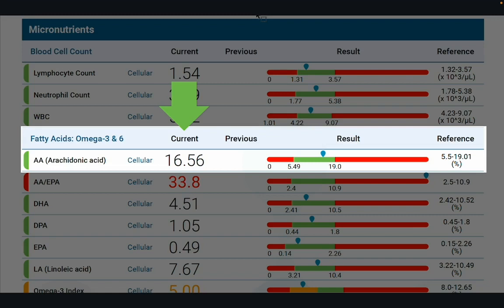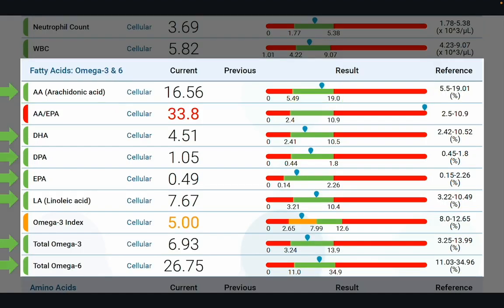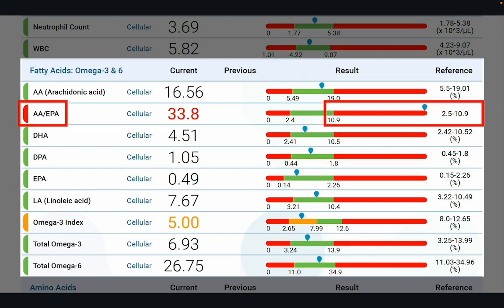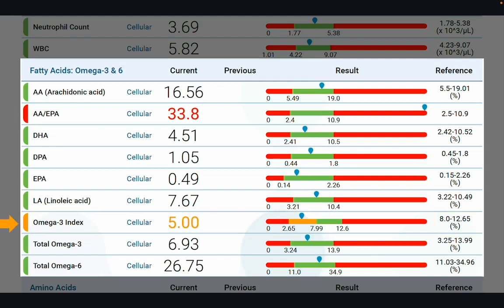Moving on to the actual nutrient levels: results are reported as both a number and plotted graphically, so you can visually see how high or low your patient's micronutrient levels are. Results in green indicate levels within the reference range — for example, this patient's levels of arachidonic acid, DHA, DPA, EPA, LA, total omega-3, and total omega-6 are all within range. Results in red correspond to levels outside the reference range — for example, this patient has an elevated AA to EPA ratio. Orange or yellow indicates suboptimal levels — for example, this patient has a suboptimal omega-3 index. Note that all fatty acids are based on intracellular levels, indicated by the word 'cellular' and a single row per nutrient.